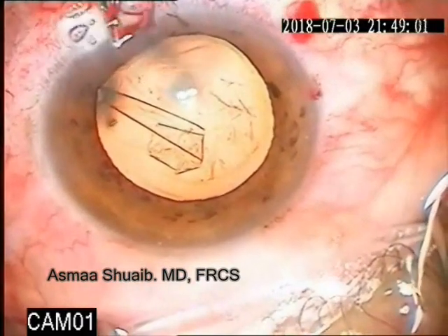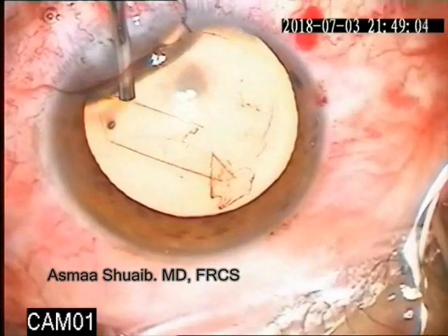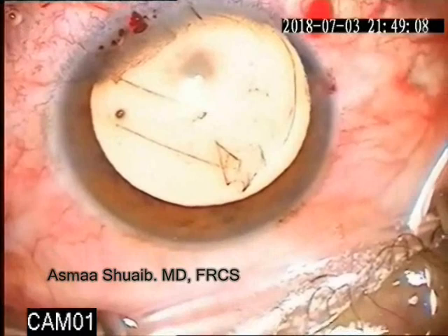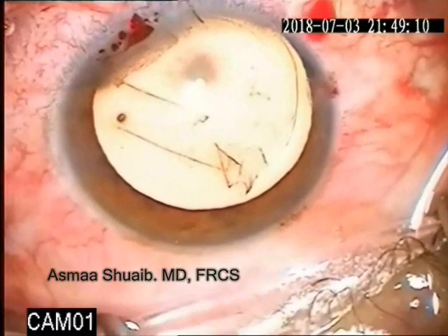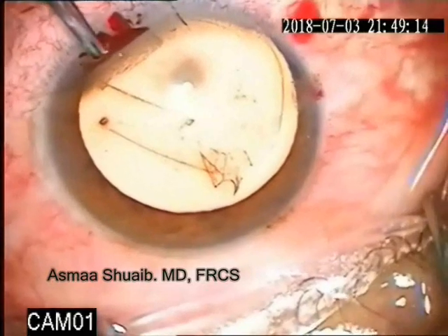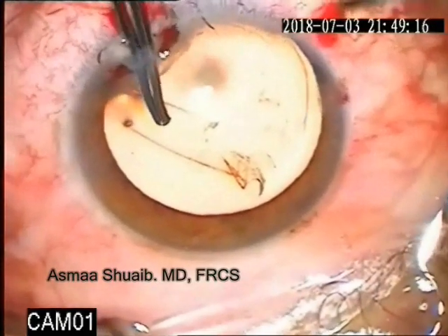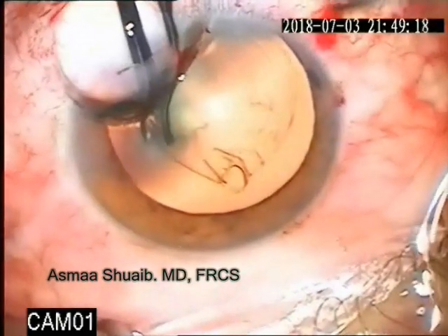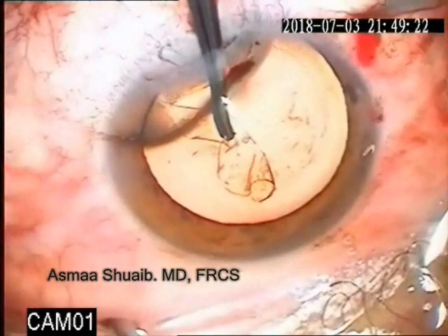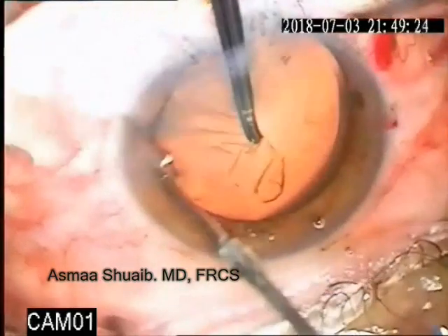You have to fill the anterior chamber with a viscoelastic material. It's better to use a visco-cohesive material and not a visco-dispersive one, which was used in this case. Then, if you can see the edge of the extended rhexis, you can use the ripping forces towards the center of the anterior chamber to complete the rhexis.